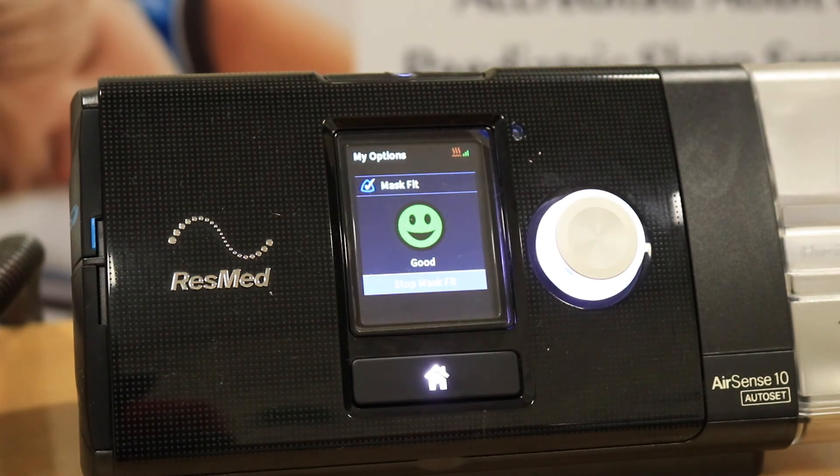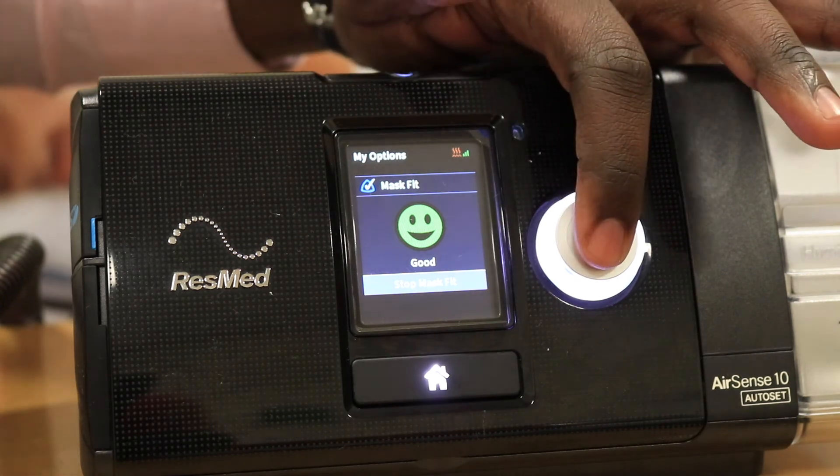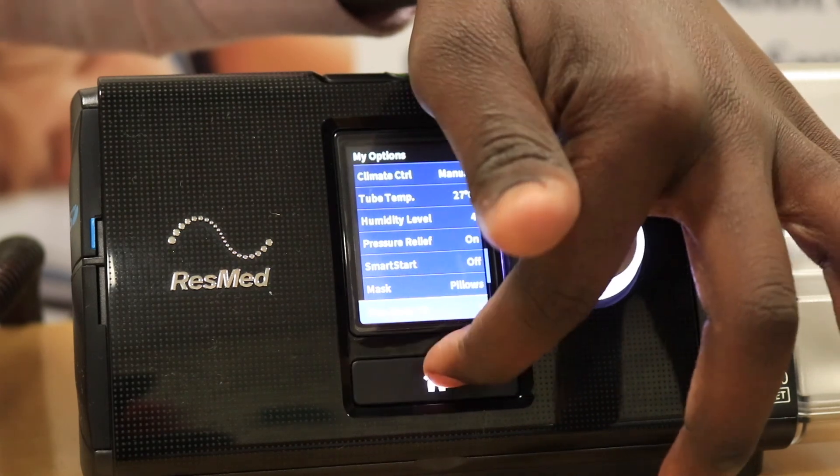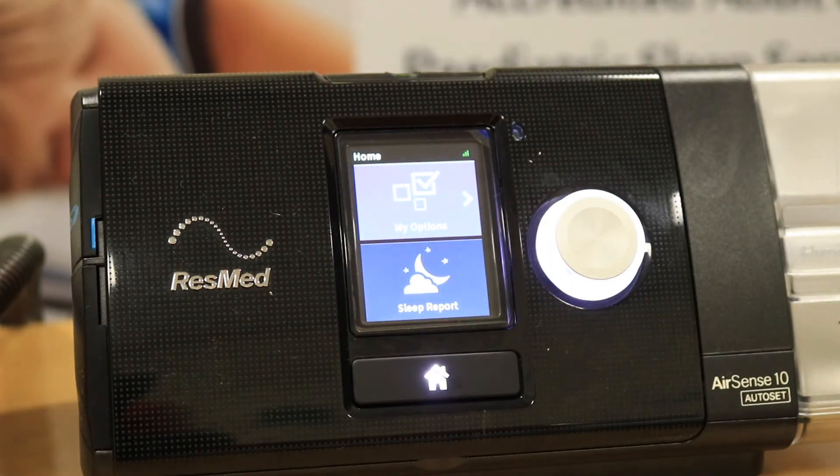To stop the fixed pressure, just push the dial, and you can then press the home button and you are ready to start your treatment for the night.